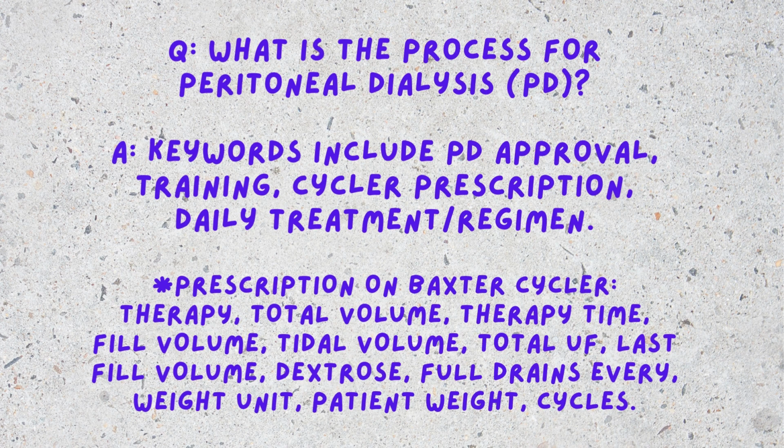For you to be eligible for that, one, you have to take ownership of your treatment. You will not be going in center. You have to manage your treatment daily at home, and that includes setting up your machine, breaking it down, connecting yourself, disconnecting, observing the germ-free protocols. Basically, your ownership of your treatment is on you. So you have to be evaluated, to present as someone that can undertake all of those responsibilities without having to come in center and have treatment in center.